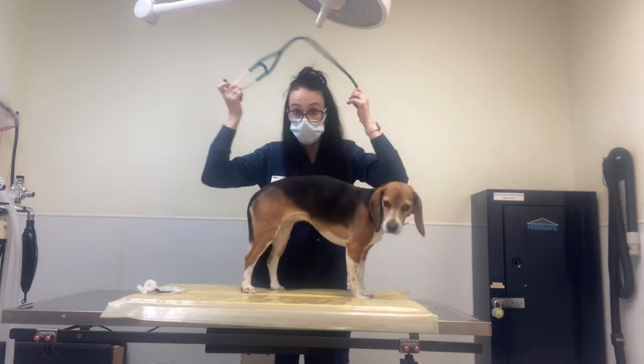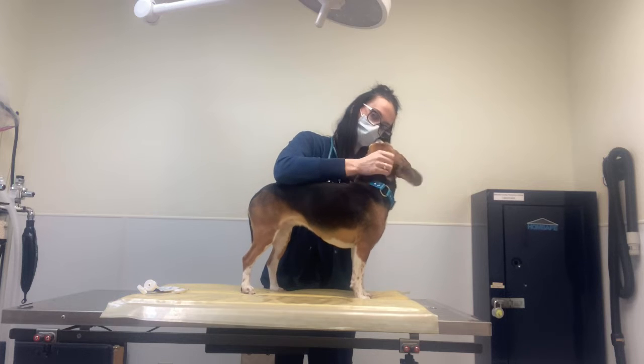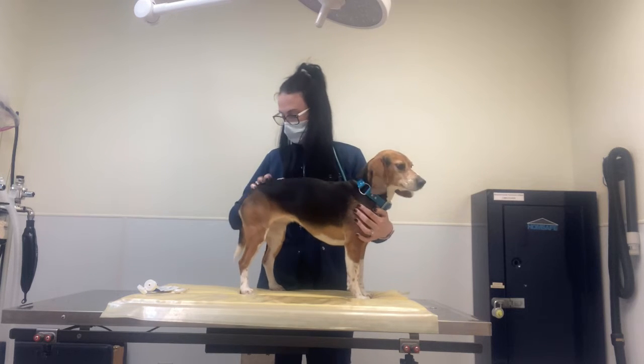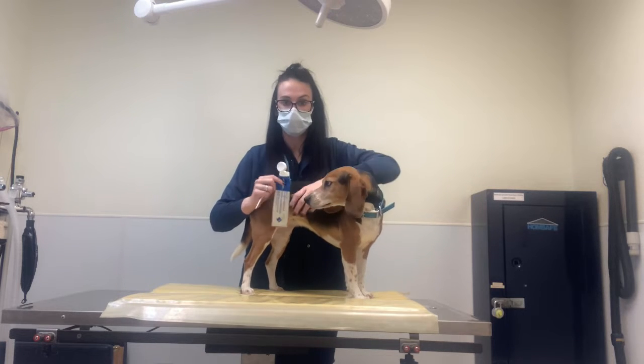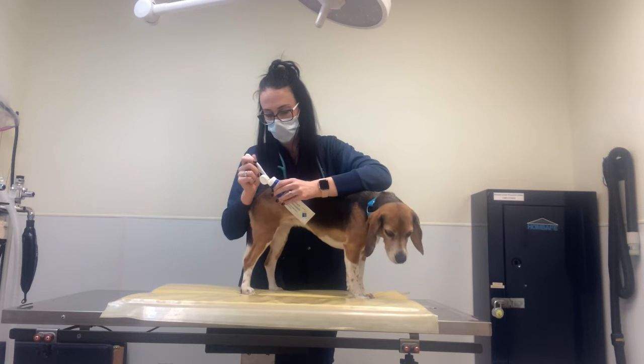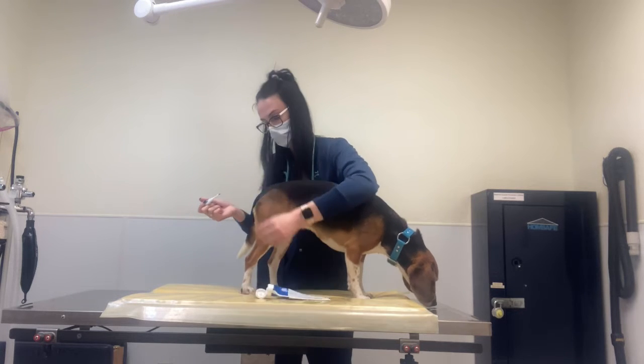Okay, so she's 120 for her heart rate, and she is 30 for respirations. Good girl. So last but not least, we'll temp her. And every time you temp, you just want to use a little bit of lube. Works a little easier. All right, come here, Zoe.